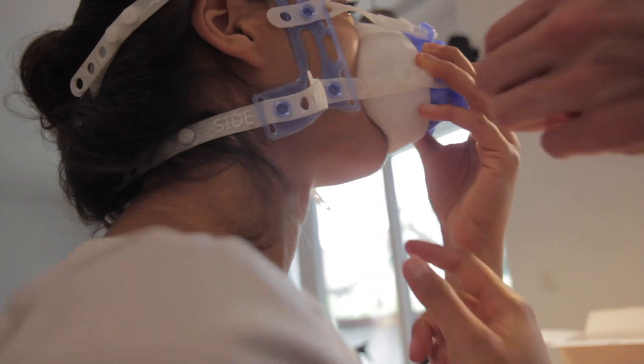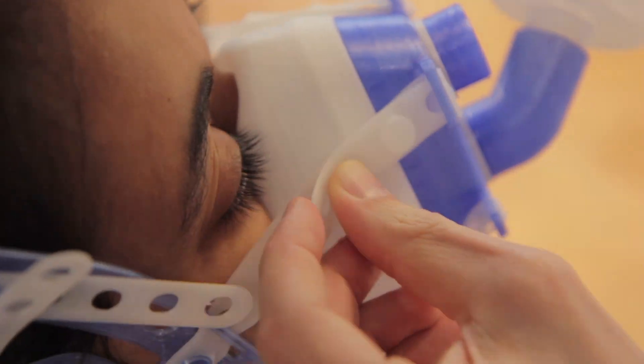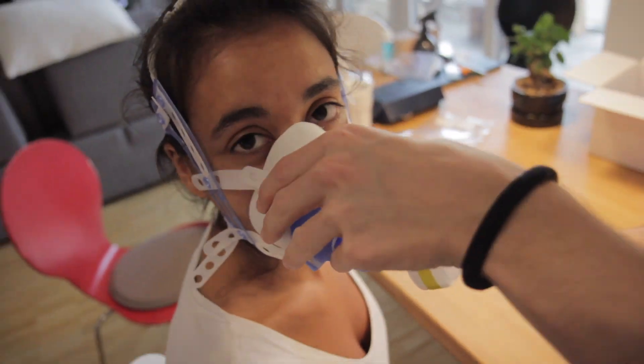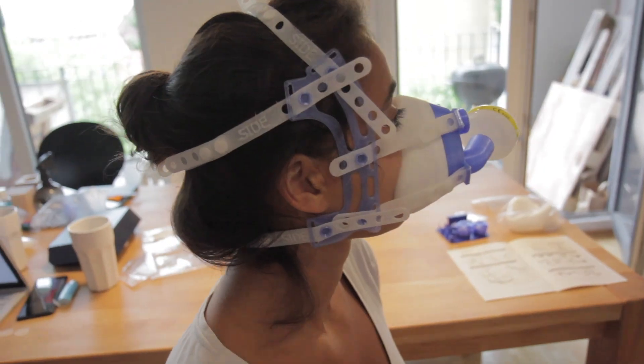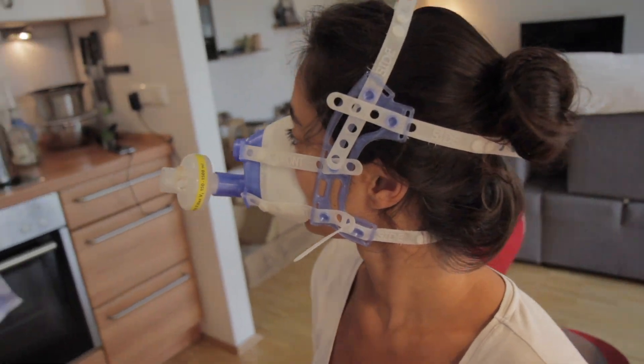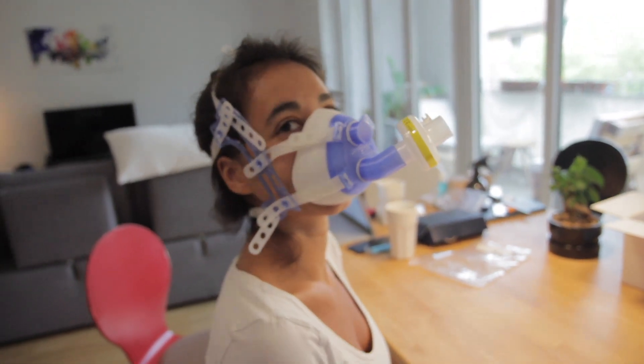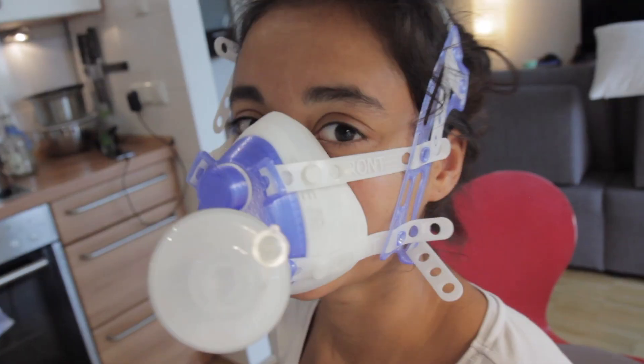To ensure a tight fit to the patient's face, you can adjust the front straps. The mask should have a tight fit to the patient's face. If any of these steps in this video were not clear, refer to the assembly manual for clarification.